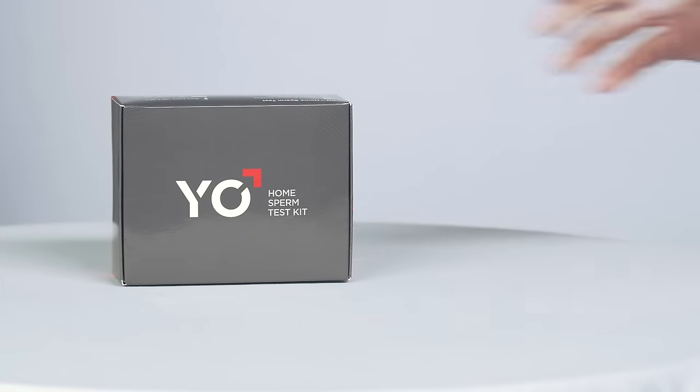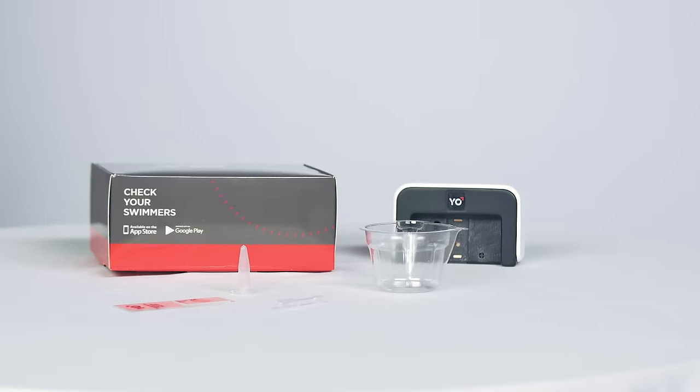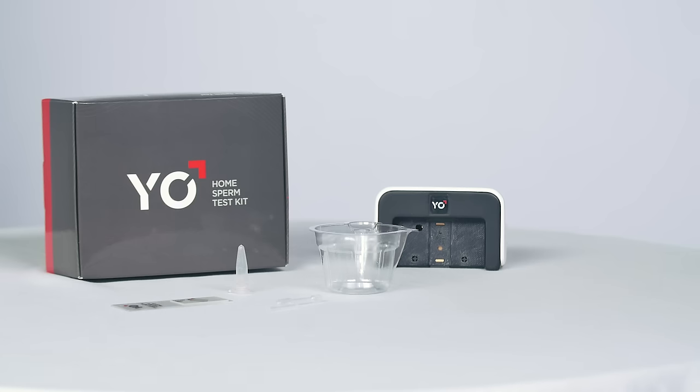Disposable supplies for two sperm tests are included in your Yo! kit: collection cups, testing slides, liquefying powder, plastic pipettes, and a Yo! clip.